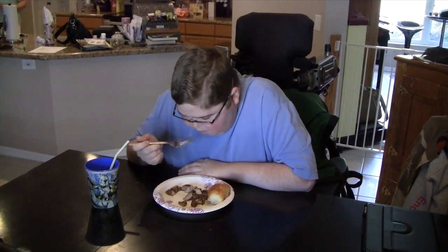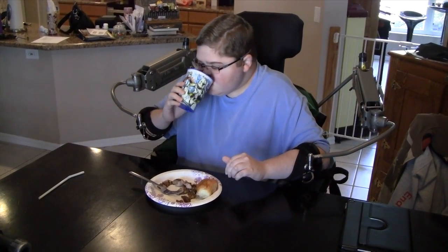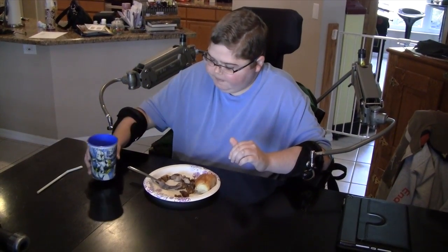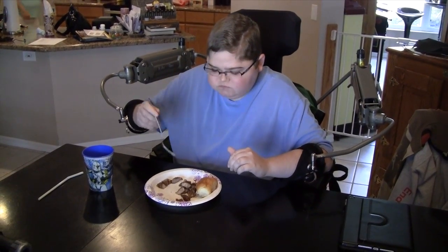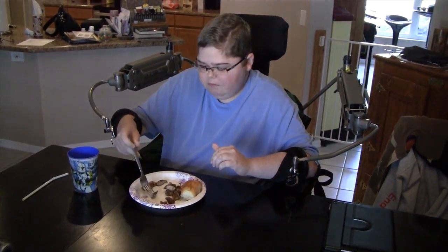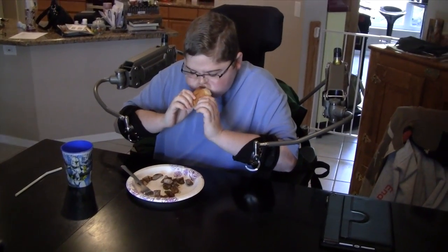We've removed the straw from Zach's cup and he's taking a drink now with the XAR. Now he's going to take a bite and he doesn't even have to bend his head down. As you can see from this video, it has made eating considerably less troublesome.